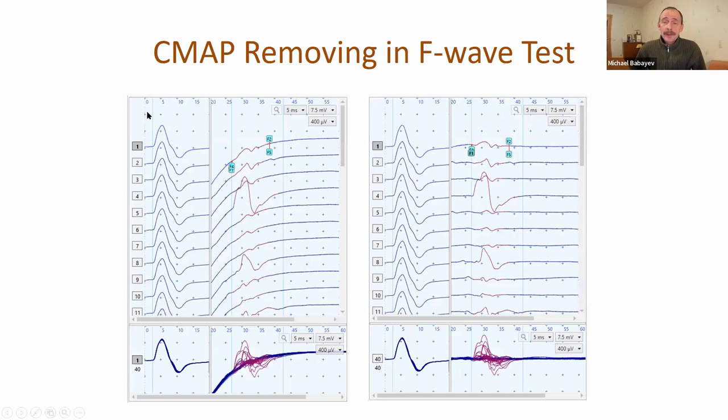We changed CMAP removing in the F-wave test. On the left side you can see the standard picture just after recording the F-wave, which has some trend - not very convenient to work with. On the right side you can see the same traces with this trend removed using only one menu command.